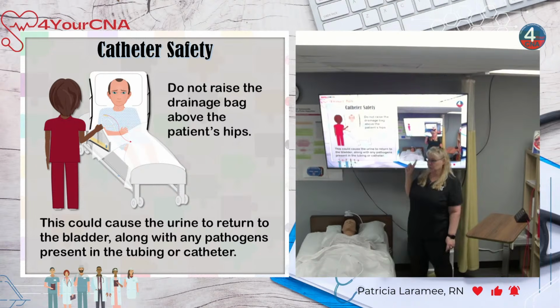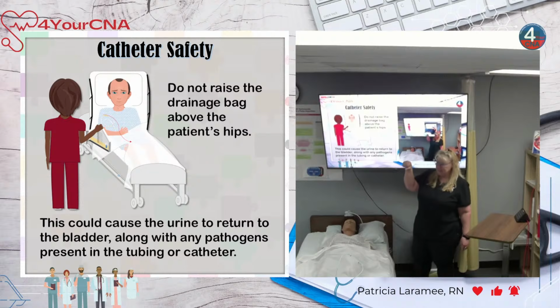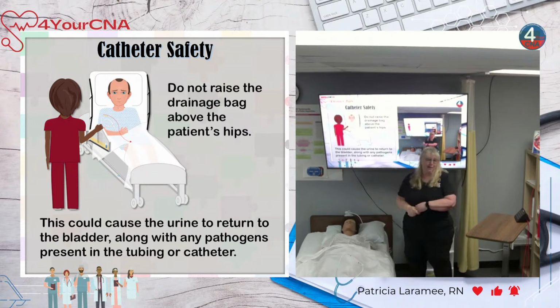This is a huge risk for our patient, but it's also really high on my gross meter. Urine should be a one-way trip. Urine should not be put back into the body in any recycled manner. That's just gross. When you hold that bag up, that's exactly what you're doing. You're taking that urine and putting it back into the body in a recycled way.